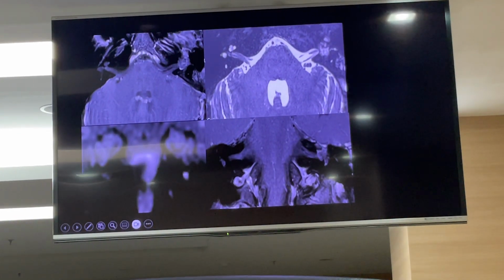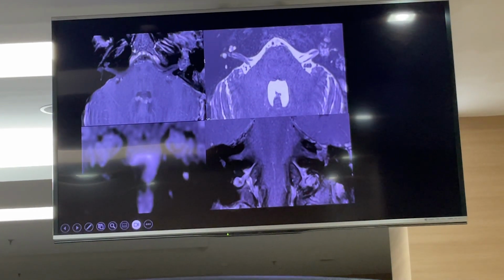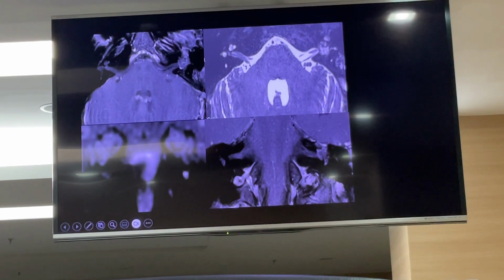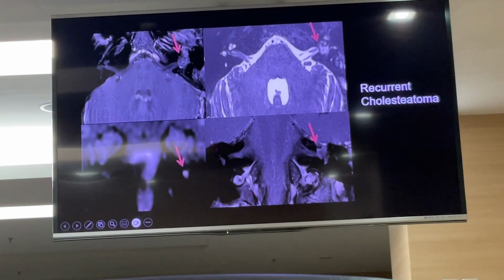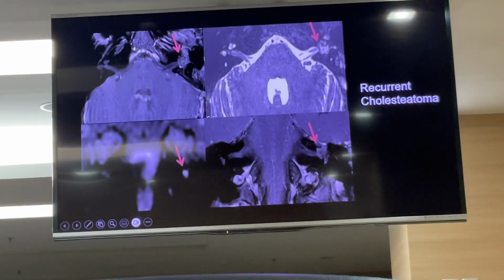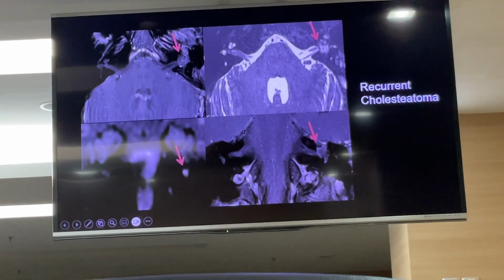But the MRI image shows a focal restricted diffusion dot in the surgical bed, because the patient had surgery a few years ago. This is characteristic of cholesteatoma, a chronic inflammation from a mass lesion that has characteristic restricted diffusion. So we use DWI to confirm the diagnosis.